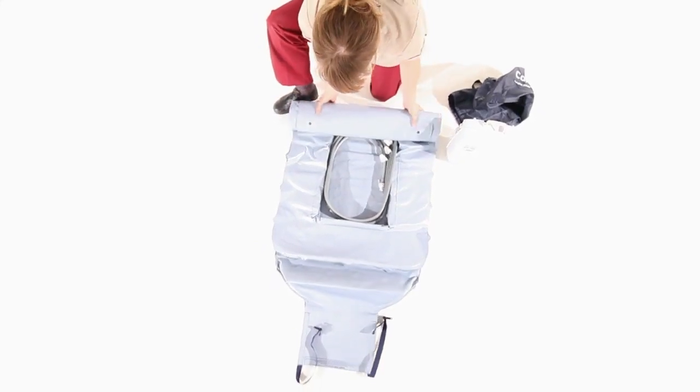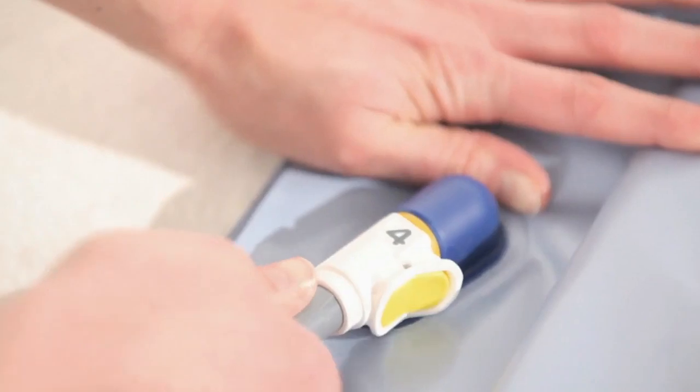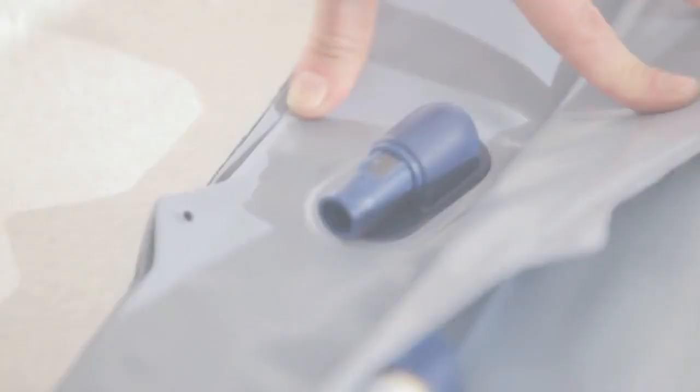The Camel is easy to unpack and set up. The four coloured and numbered airlines are matched and simply connected to each section of the Camel.